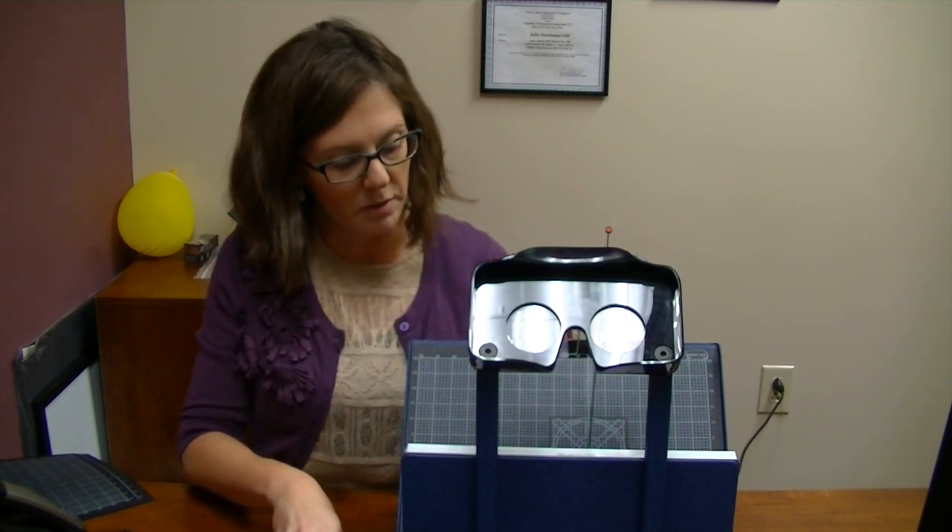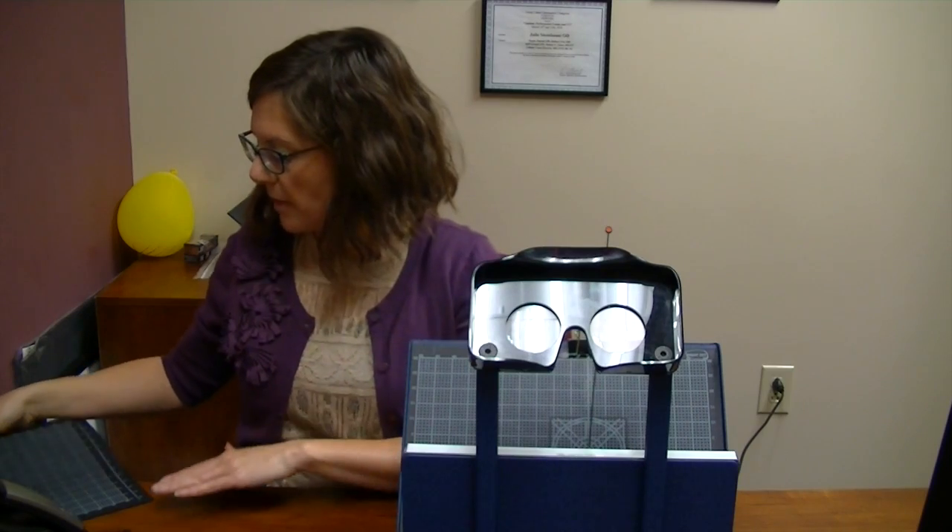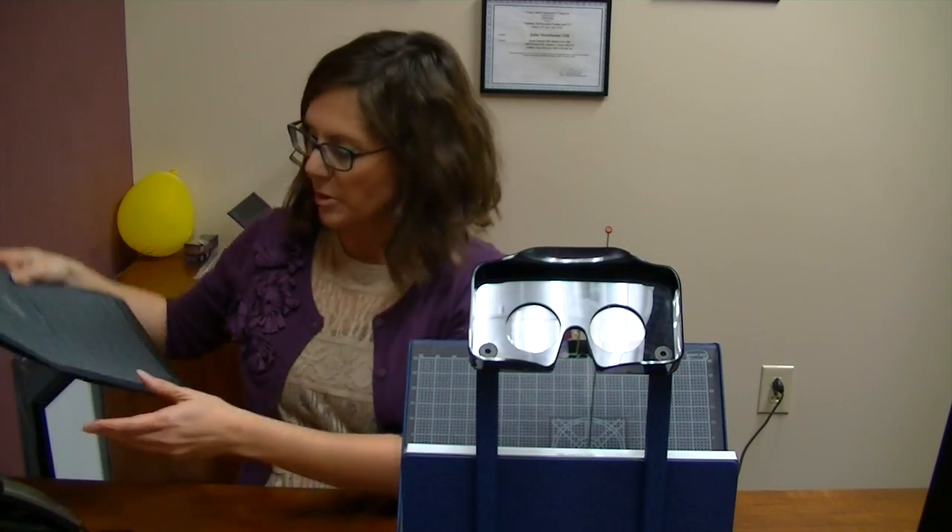As we go through this test, we have different colors that we range through. We start with green, then go to red, then blue, and then white. Each one of them has a different meaning in terms of what the person can see.